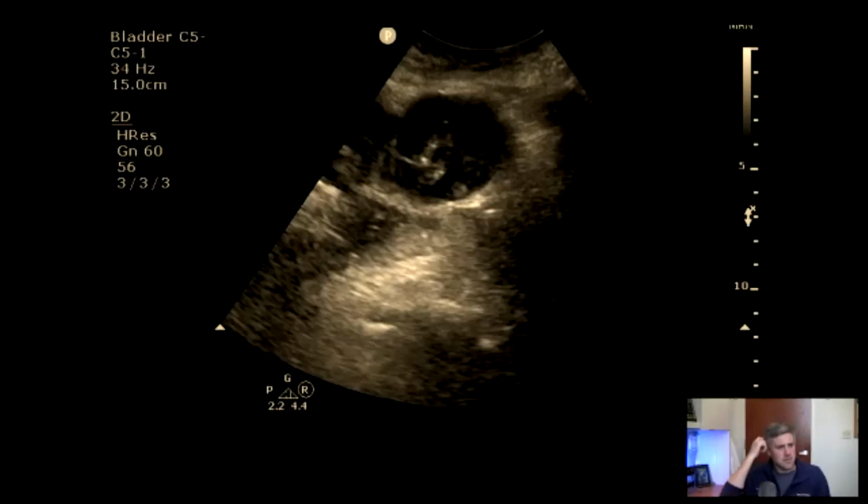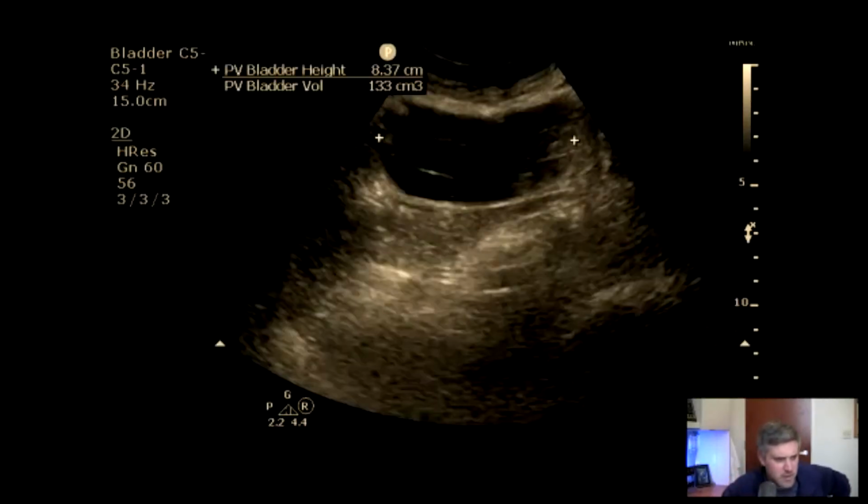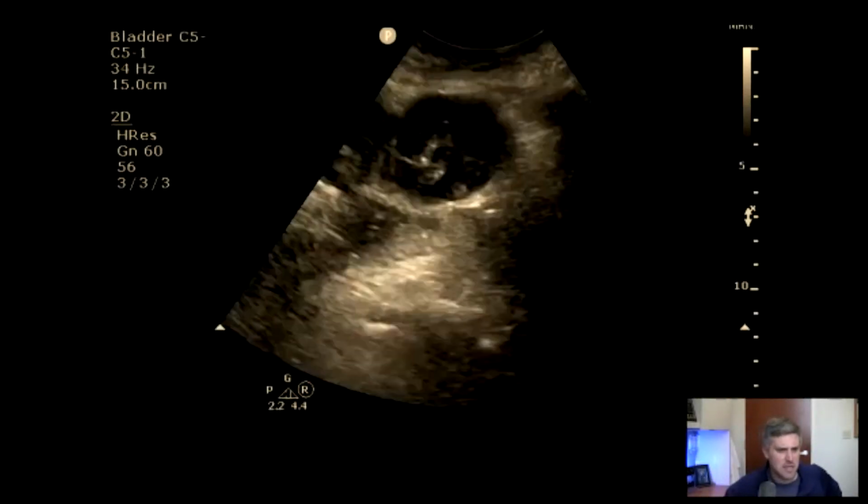But we should be asking ourselves, okay, number one, it doesn't fit the shape characteristics. I mean, from this standpoint, okay, maybe it's boxy, but it's very shallow, right? It's kind of odd. It doesn't quite fit the shape that I'm expecting. This one's very rounded, not that cone-shaped appearance. But what's all that stuff in it? And again, I said that there could be echogenic stuff in the bladder. So maybe it's a hematoma, maybe it's some other thing, right? Doesn't necessarily rule it out per se, but it definitely should cause us to question.